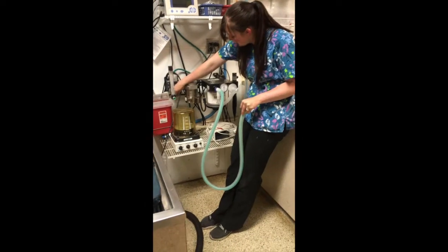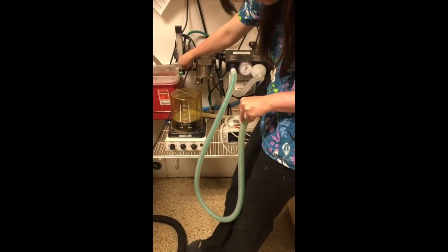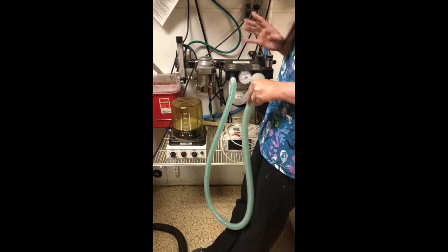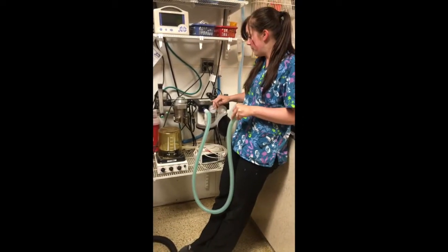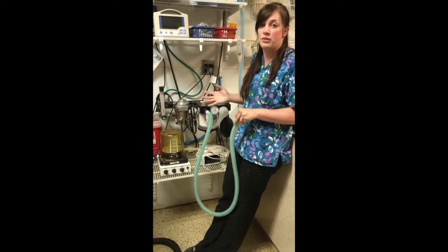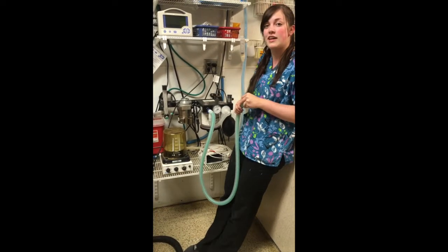And I'm going to press my O2 flush until our reading on our centimeters of water pressure is at about 20. And you can see that it is staying at 20. That means that we have no leaks in the system. It's keeping the pressure, and if it were leaking, you would easily see that pressure dropping back down, and you would be adding more oxygen, and it wouldn't be holding pressure. So we have no leaks in the system, and our pressure leak test for the day is done.